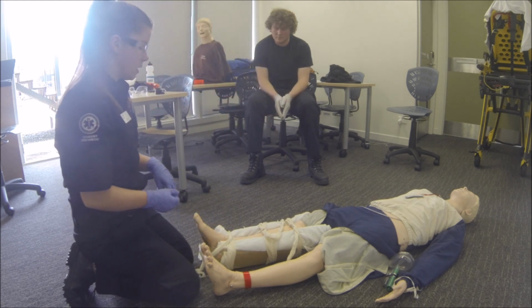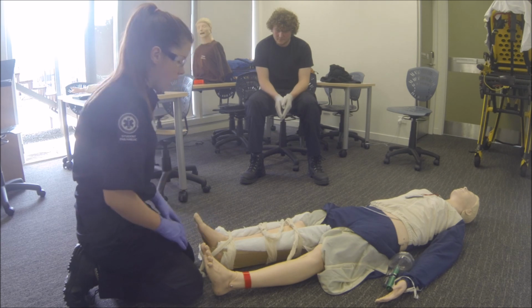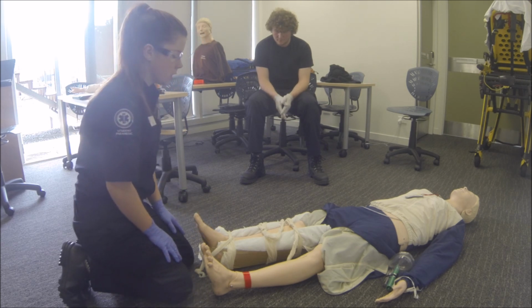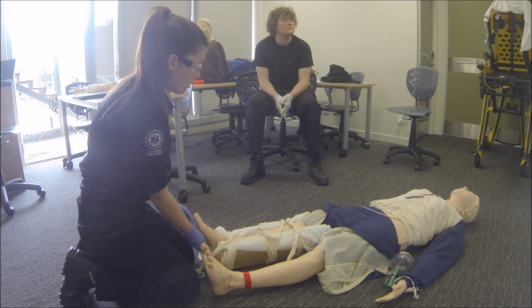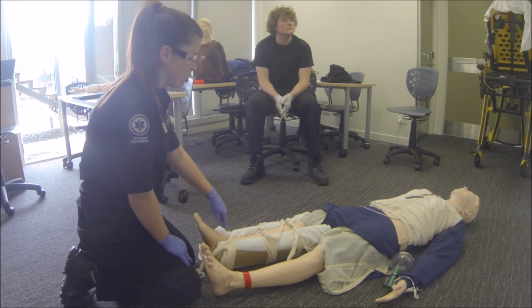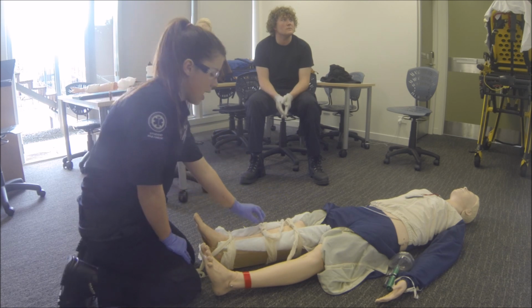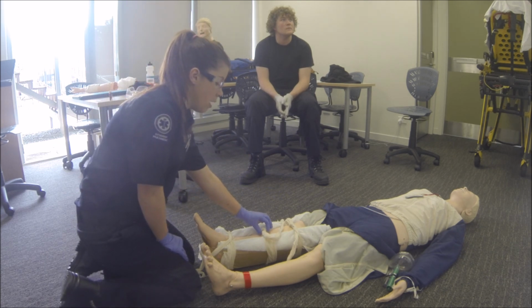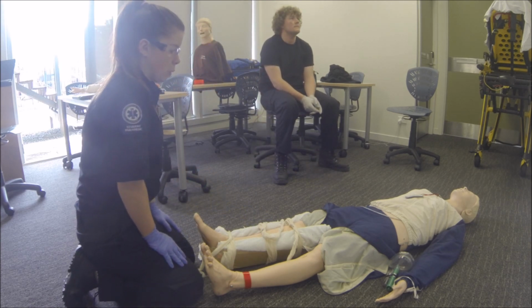Okay, so what I've done is use 2 towels to support the leg in the splint, and then I've used triangular bandages to tie the splint off. One is firmly around the ankle and under the foot, which is below the injury. One is firmly above the injury, and then the last tie is around above the injury site, but it's not tied as tightly, so as not to cause the patient any more pain.